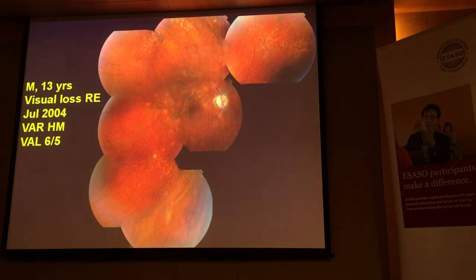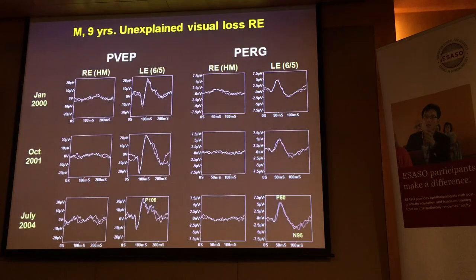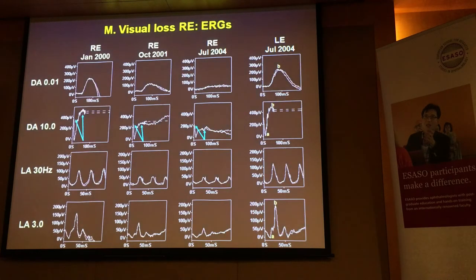Patient now who we thought had old inflammatory disease coupled with new inflammatory disease. So it's a 13-year-old. We first saw him when he was 9. This is the current state of play. What we saw in blue is at 9, he did have some function remaining in his right eye. He's got buried drusen, which complicated things. Nerve head drusen.